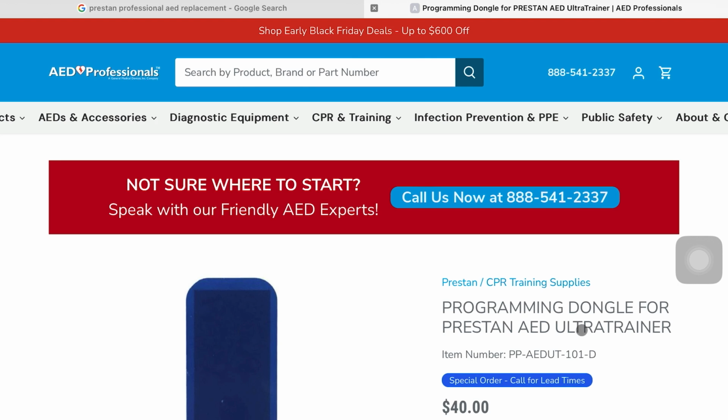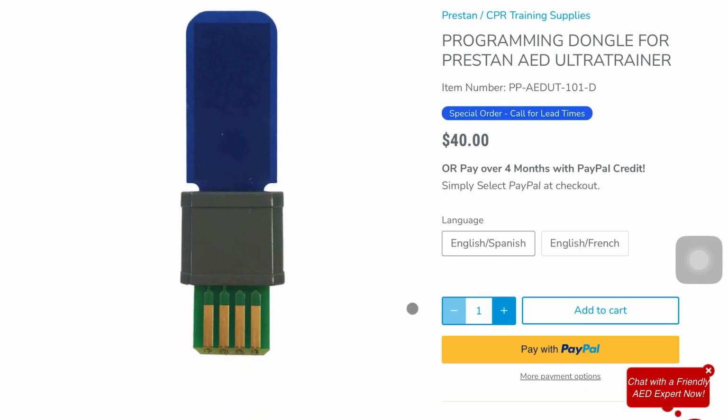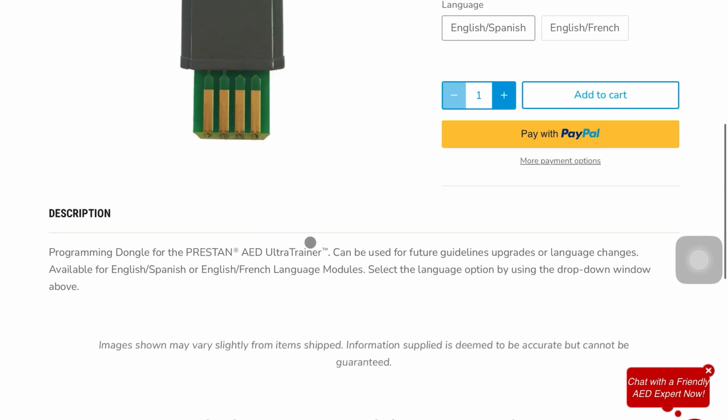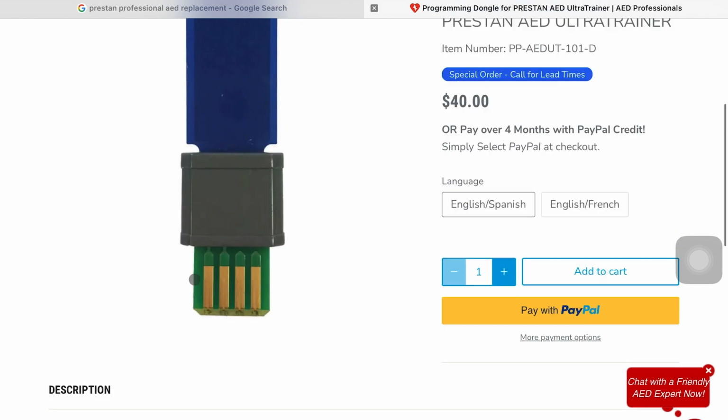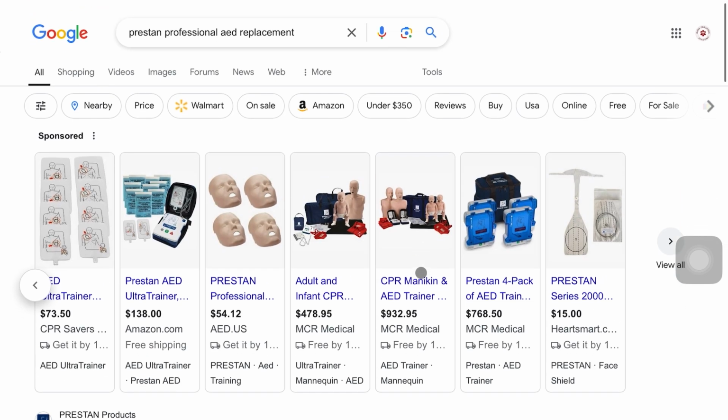And then this here is pretty cool. It's just a little dongle that you can plug into the AED when there's software updates for it, or AHA or CPR updates for it. And that's just going to be how you do those updates and not have to buy a whole new AED trainer. But yeah, that's about it.